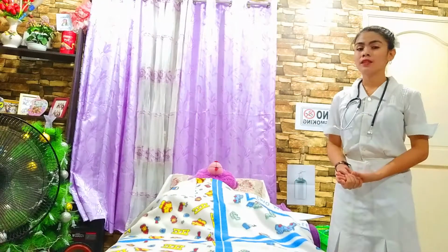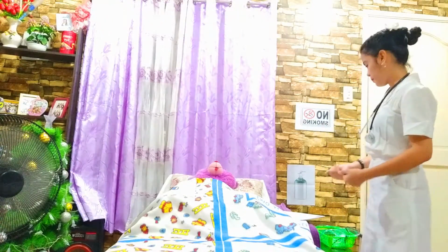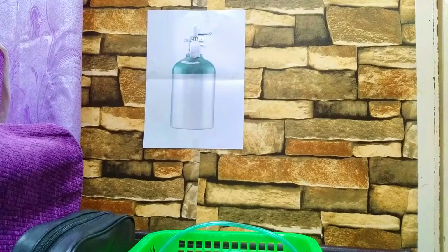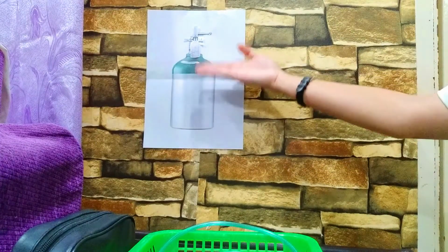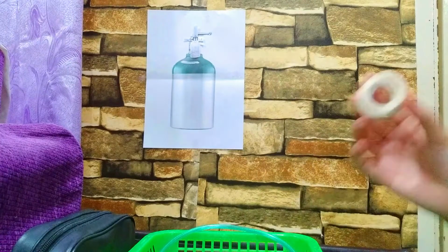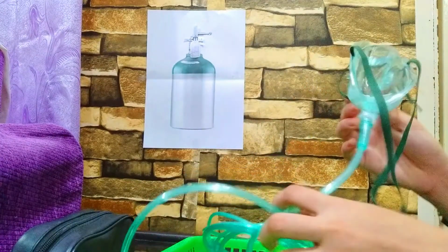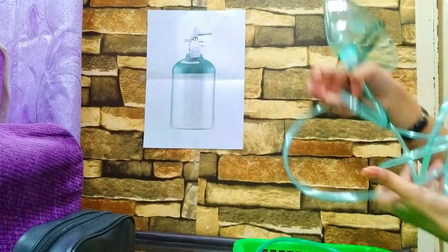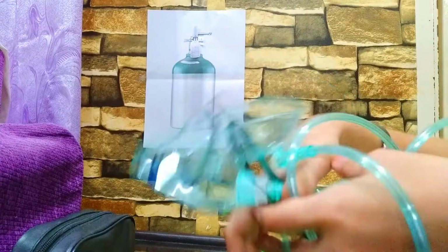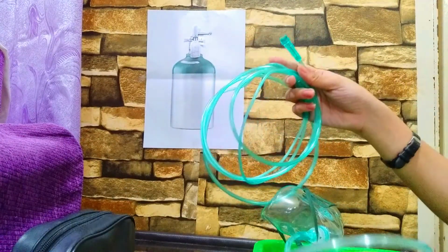And then next in the procedure, we need to assemble all the equipment. We have here the improvised oxygen tank and the improvised flow meter, the tape, this is optional, the simple oxygen mask, and also the nasal cannula.